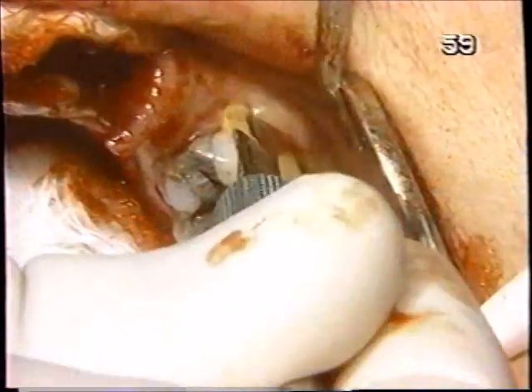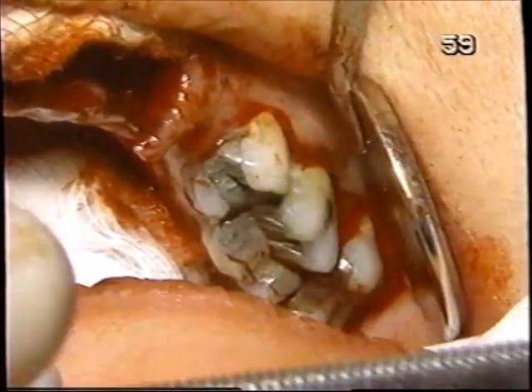Now this is a canine, badly decayed. Looks like it may have had a crown on it at one time. Another long one. Wants to come buccally because that's the angulation of the palatal root.